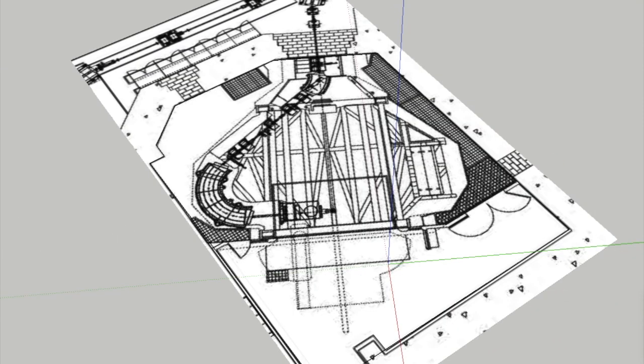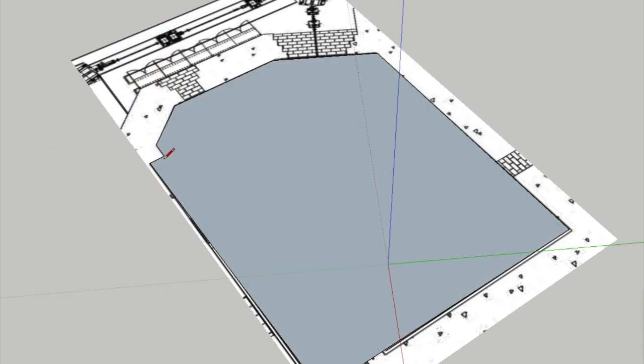Now we're going to do the same with the Gantry, and we can see the shielded walls in the Gantry floor plan there, and we can mimic the square foot area at the isocenter level by that blue area.